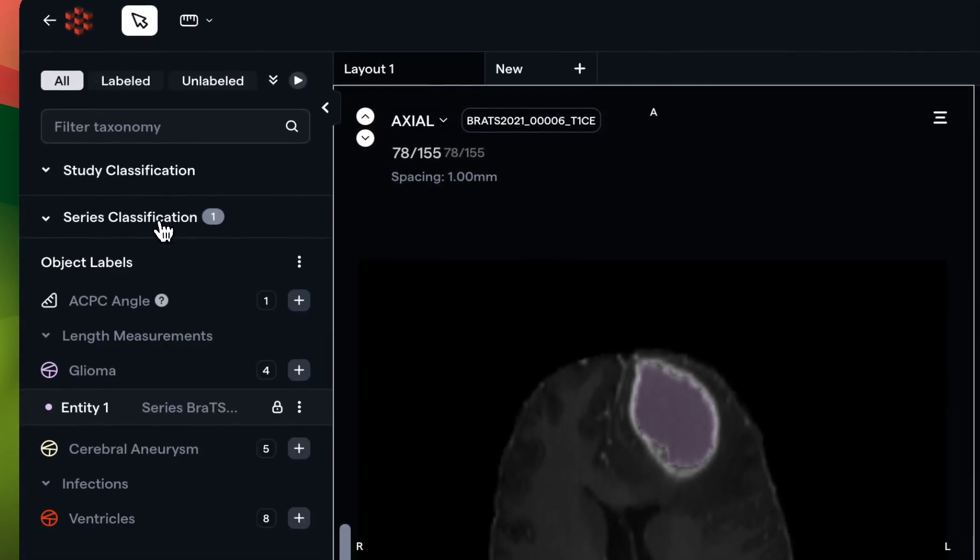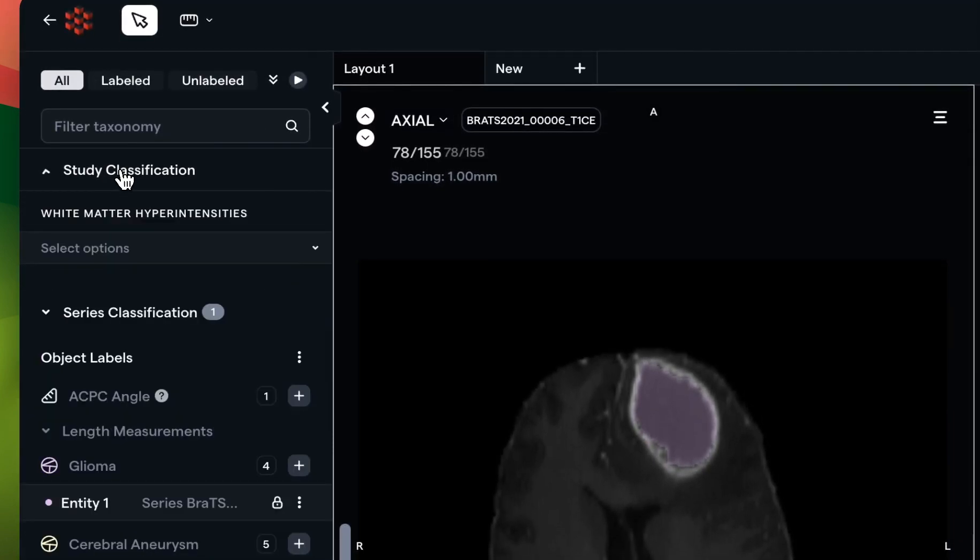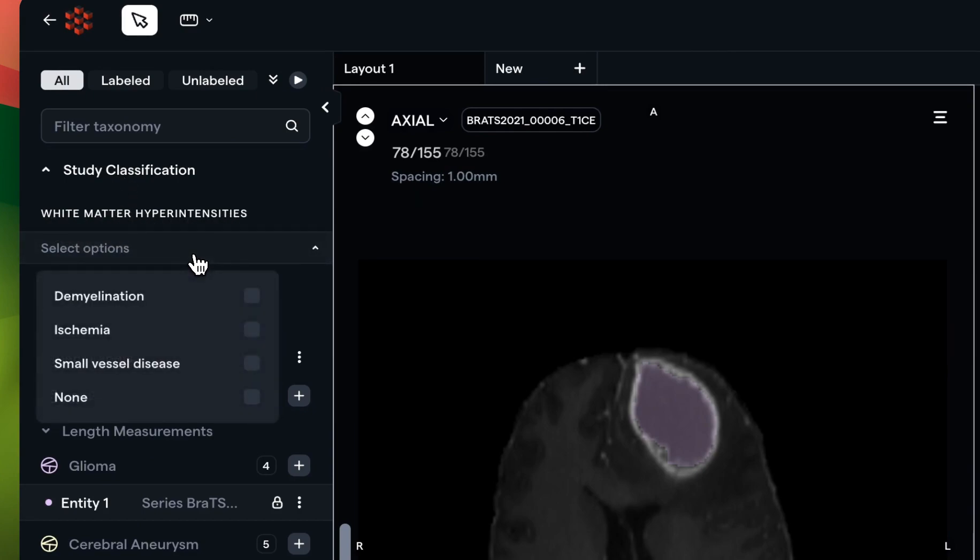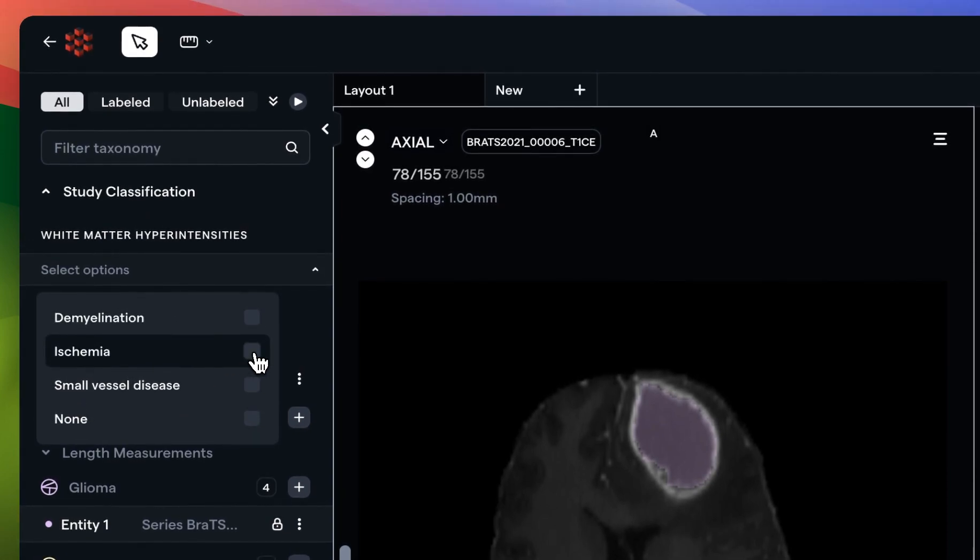We also have a study classification. White matter hyperintensities - this one's slightly different but I can choose from a variety of options here. Let's say that I found an instance of ischemia. All I have to do is click this field and you'll see that data point is reflected in the study classification itself.